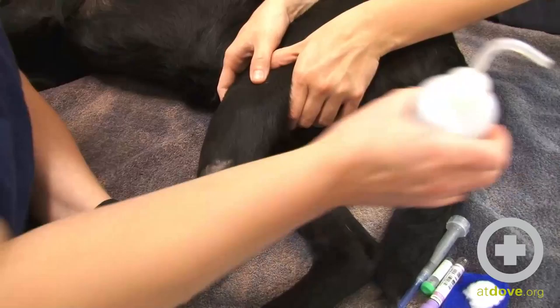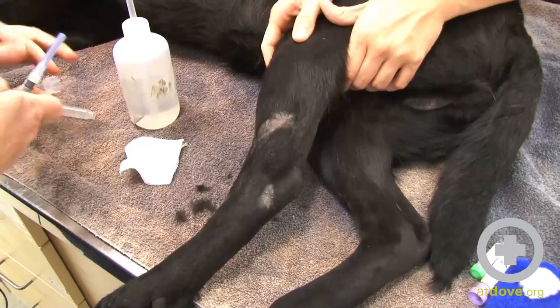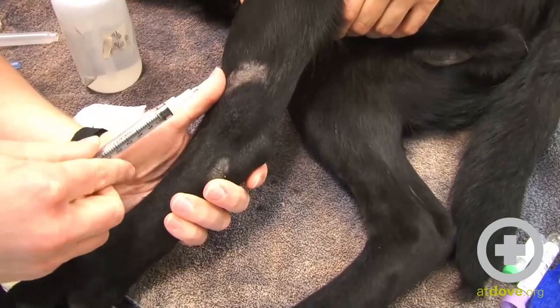The trick to these saphenous veins is that they are really superficial, and so a lot of times you think you're going to be in it and you're actually underneath it. So I put a little bit of alcohol on it. I've got my syringe, so I'm going to introduce it bevel up.